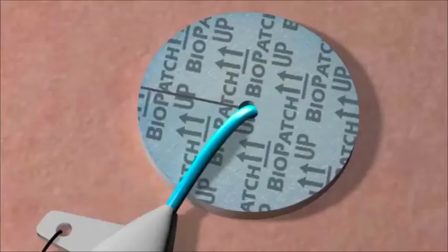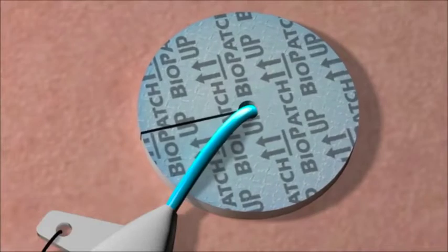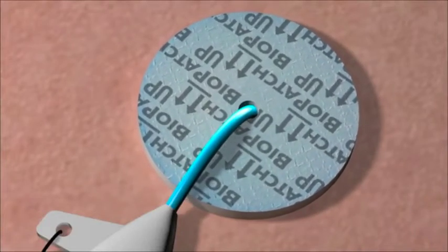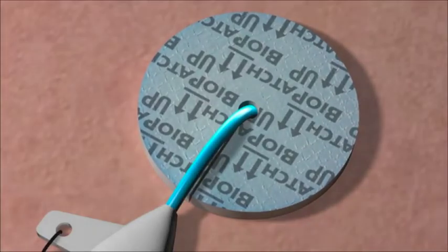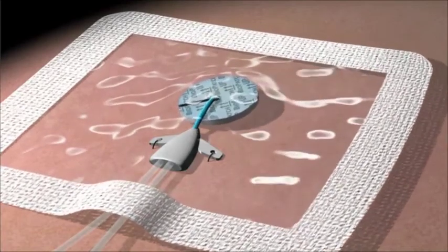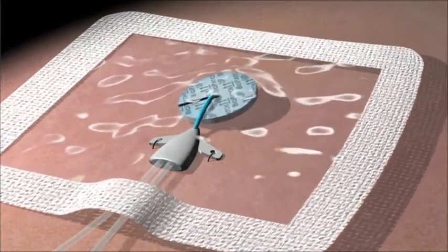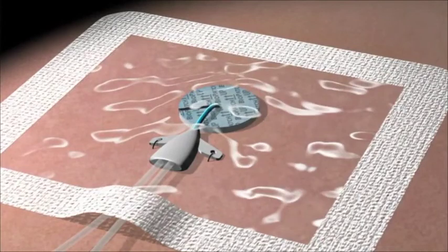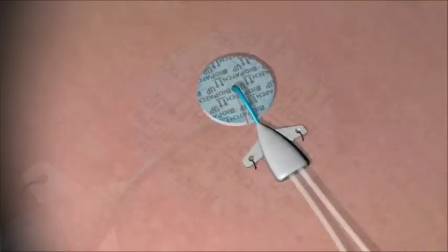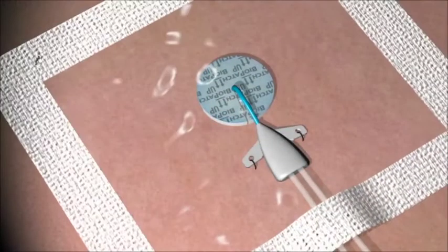In order to ensure easy removal when used with a film dressing, place BioPatch around the catheter in such a way that the catheter rests upon the slit portion of the BioPatch. If the slit is not properly aligned, the catheter can become trapped between BioPatch and the transparent film dressing. To maximize efficacy, make sure the edges of the slit are touching and the BioPatch is in contact with the skin to achieve 360 degrees of coverage around the catheter.